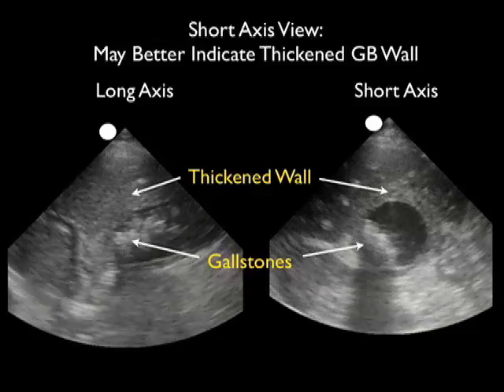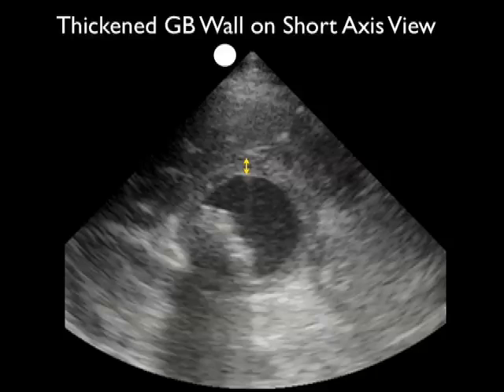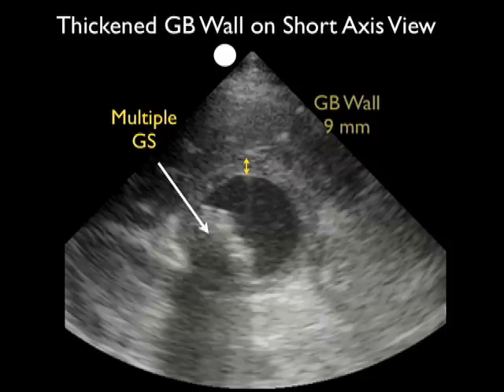This patient also had a positive sonographic Murphy's sign. Here I'm going to still that last image of the gallbladder in short axis configuration, and we see the anterior wall of the gallbladder well delineated. Notice the calipers across with a measurement of nine millimeters, fulfilling the criteria of a thickened wall.